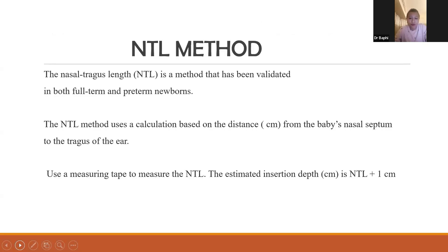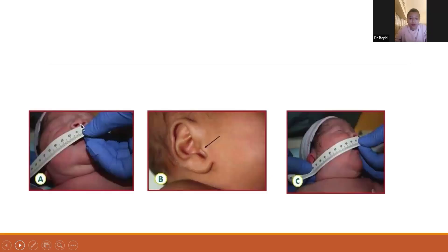There are several methods to measure the length of the ET tube. One is the nasal-tragus length (NTL). The NTL method has been validated in both full-term and preterm newborns. It uses a calculation based on the distance from the baby's nasal septum to the tragus of the ear. We use a measuring tape to measure the NTL, and the estimated insertion depth is NTL plus 1 cm.